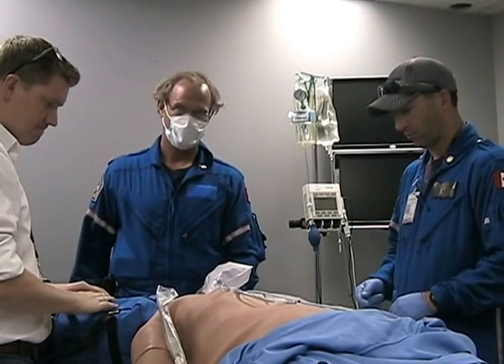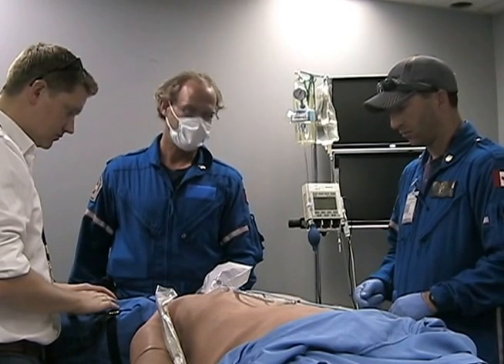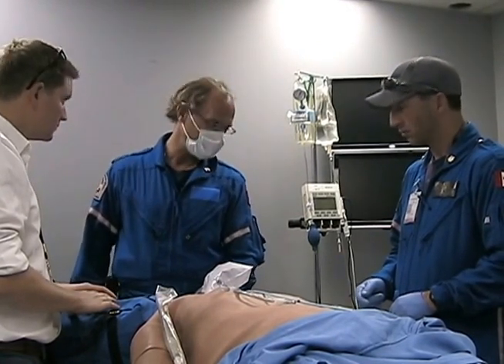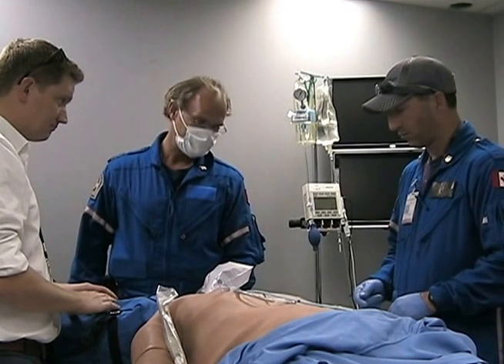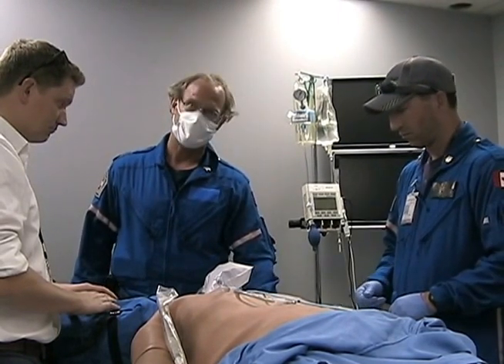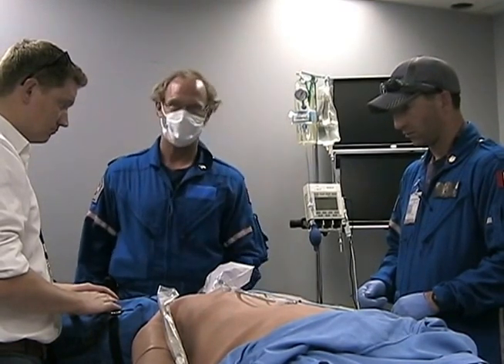Okay. Verbalize algorithm and plan A, B, C plus failed airway plan. Okay, he's an easy algorithm, just so everybody's aware. A is going to be direct laryngoscopy. B backup is going to be our blade change. We also have our bougie here. Position is optimized, and then ultimately we have our LMA that's going to be as a backup in case we have a failure with the actual intubation, and worst case scenario we have our Crico.